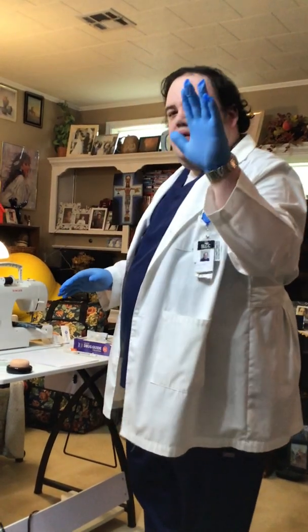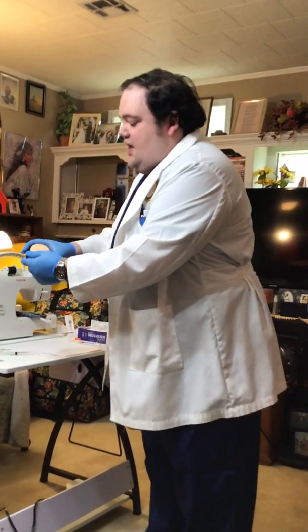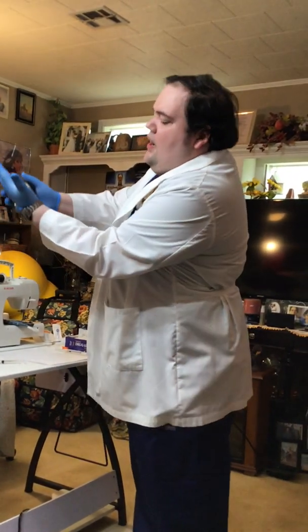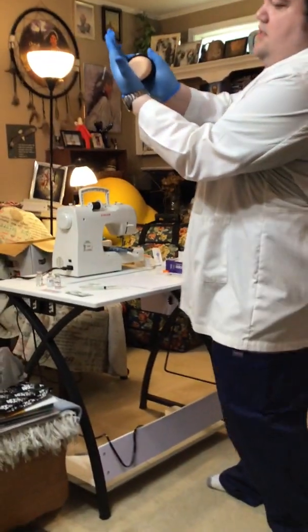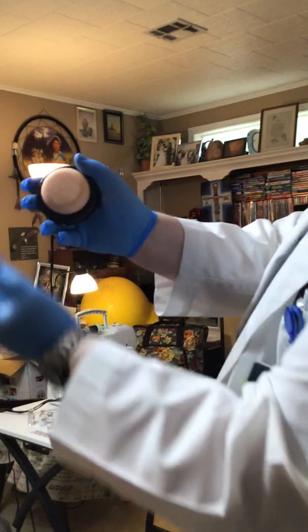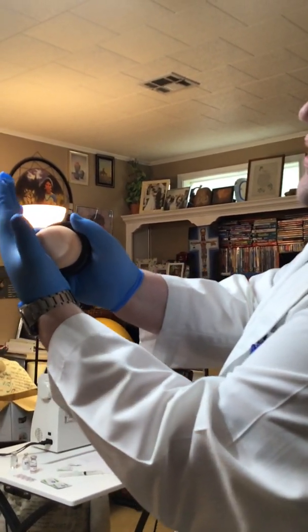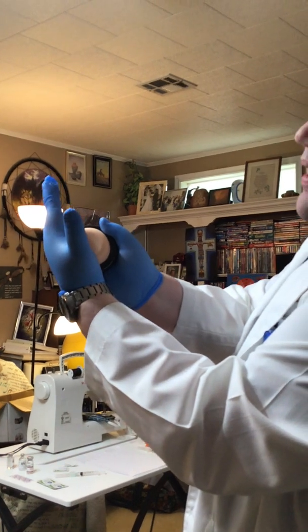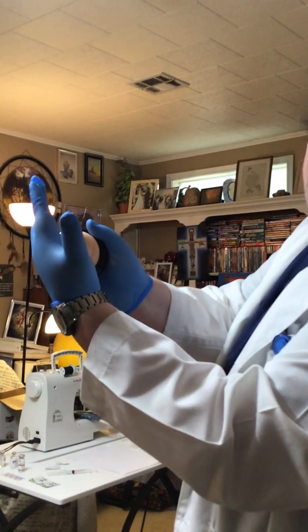I'm going to take my non-dominant hand, take this part of the hand, and move the skin over like this. Can you see that? If this is the side of the hip, I move the skin over like this. Then I take my dominant hand and insert the needle into the muscle.